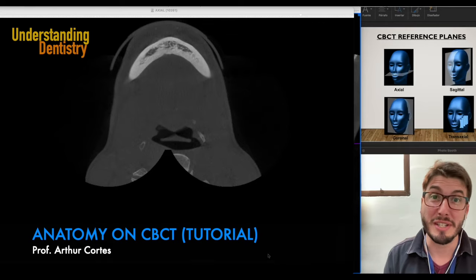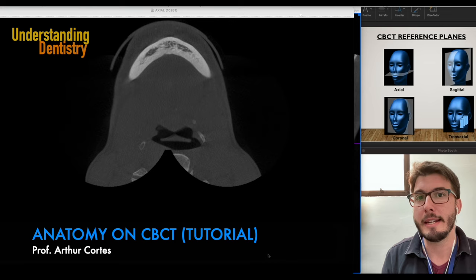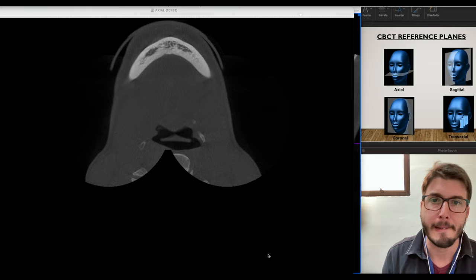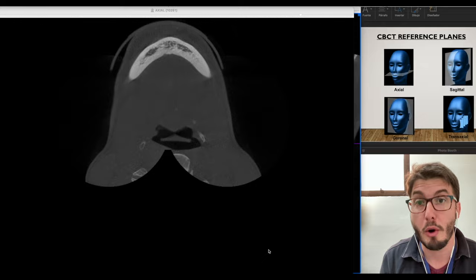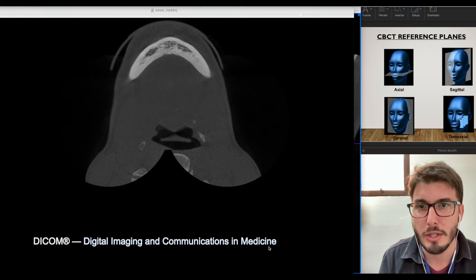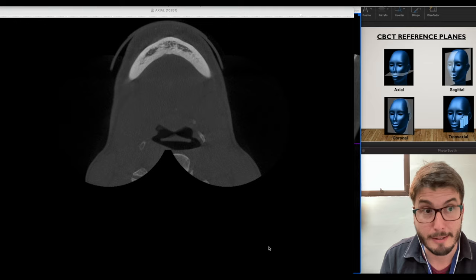Welcome to this tutorial about maxillary and mandibular anatomy on CBCT. I'm also going to include some facial and cervical structures, as they are always important as well. Here we have the axial slices — the raw images of the CBCT — and they are DICOM files. From these images, the software algorithm will reconstruct the other planes.